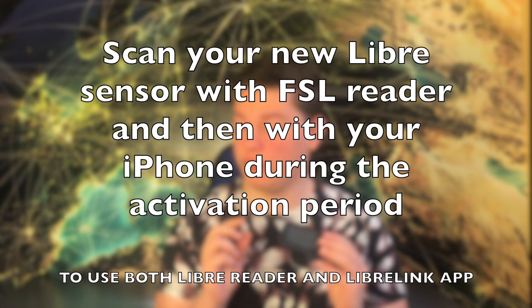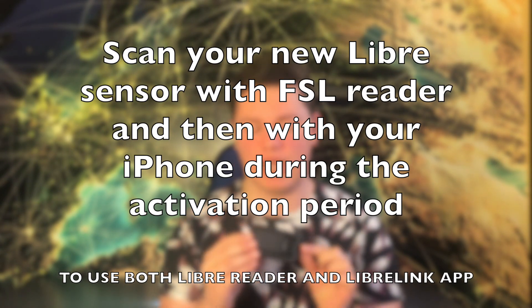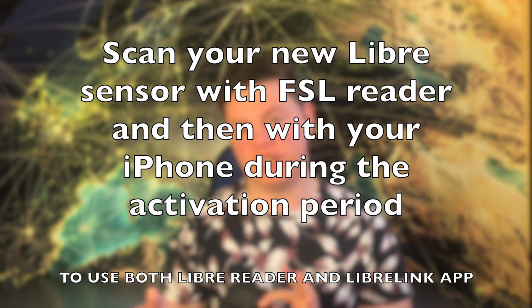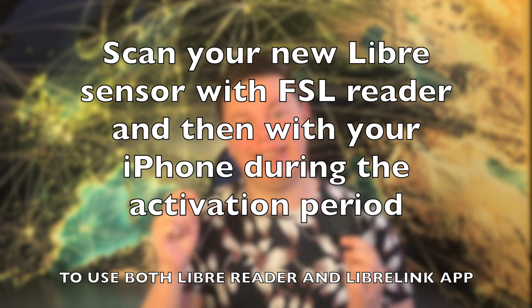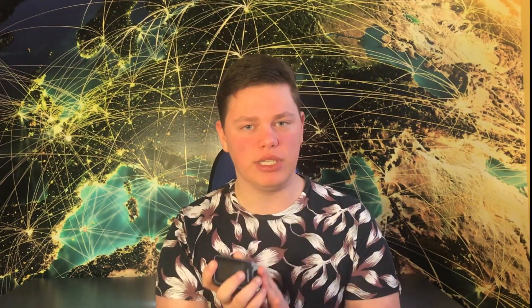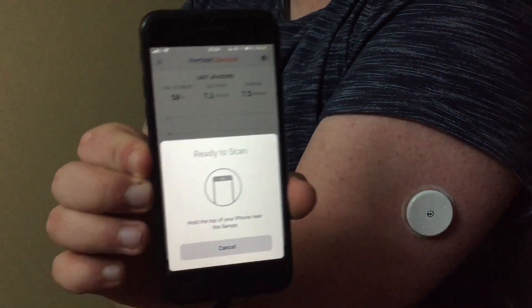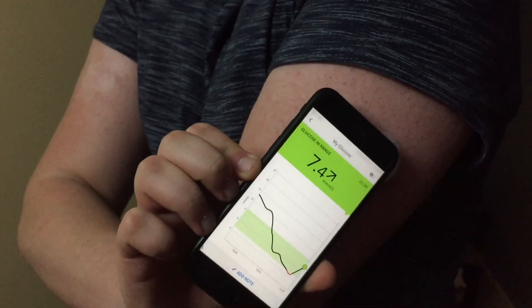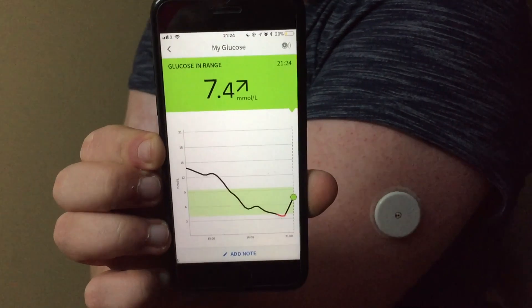In order to use both, you need to scan your brand new Freestyle Libre sensor with your Freestyle Libre Reader, and then within the one-hour activation window you need to scan it again with your iPhone and the Libre Link app. After the one-hour activation period, both the Freestyle Libre Reader and the iPhone will be able to scan and read data from the sensor for the whole two-week period.